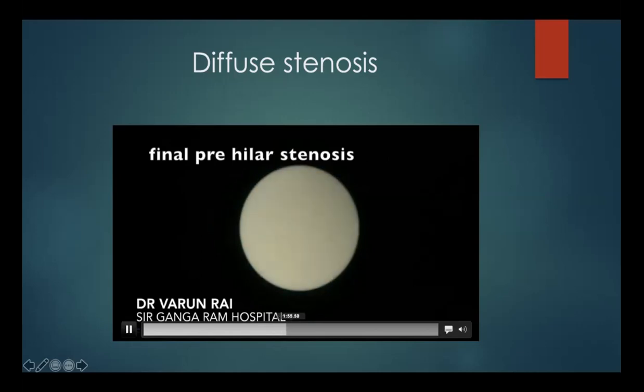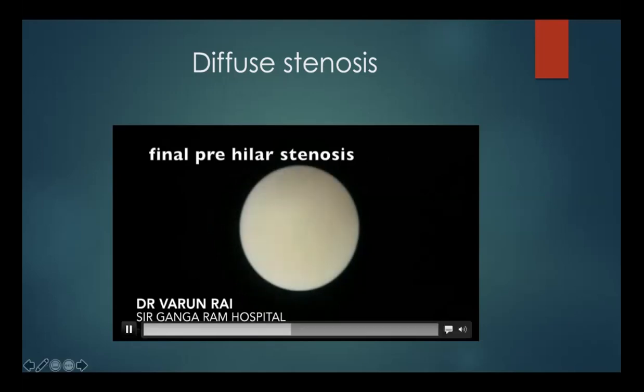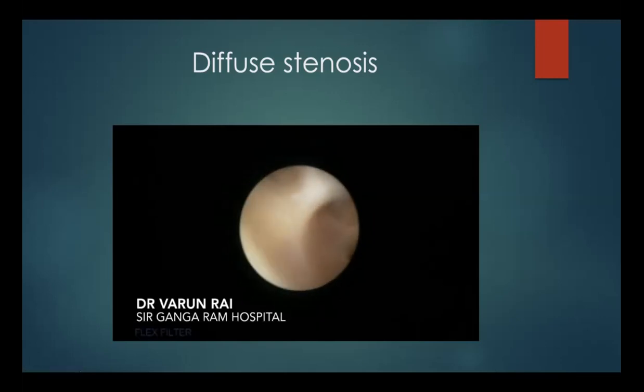So once we reach the hilar area, then you see the sudden dilated segment post the hilum and your branches as well. Once you reach this area, you know you're good because you've reached your hilum and your S3 stricture has been negotiated. Once you do that, of course, you give your steroid wash, you do your stenting, and you do everything, and usually the patients respond quite well.